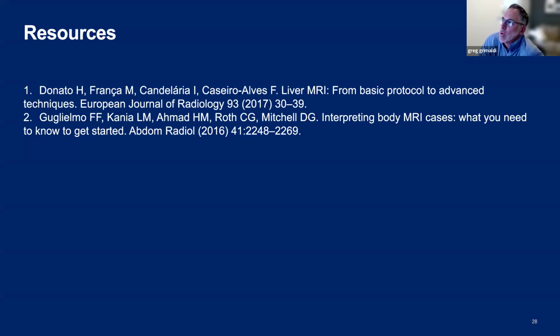When you use Y90 as opposed to the other methods, so let's start with the different methods that we can use for treating liver disease. If you have a lesion and you do things like a bland embolization or an ablation, anything that enhances within the treatment zone is going to be viable tumor when you do an MRI or a CT after doing those therapies, ablative therapies, or just bland embolization. If you use radioembolization, lesions can still enhance after you do the radiation or radioembolization. And so what you're looking at is to make sure that things that enhance decrease in enhancement over time, and there's no new enhancement, or there's no new restricted diffusion or new T2 signal.